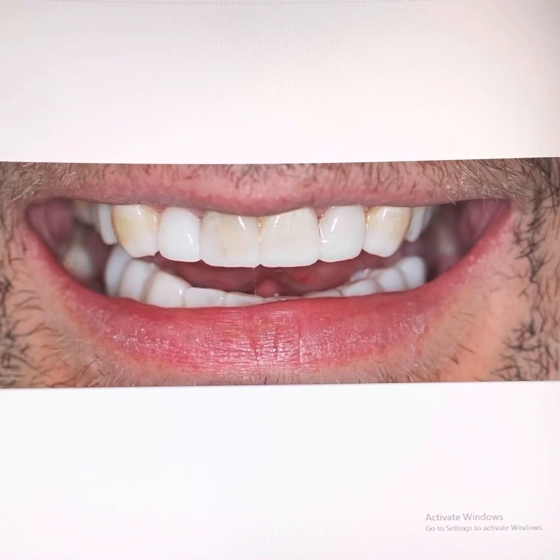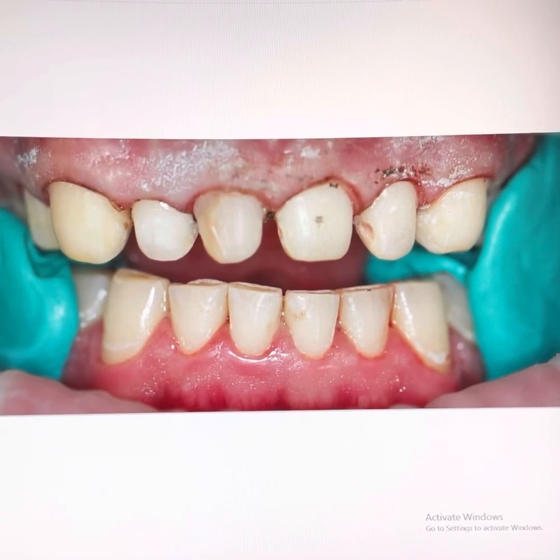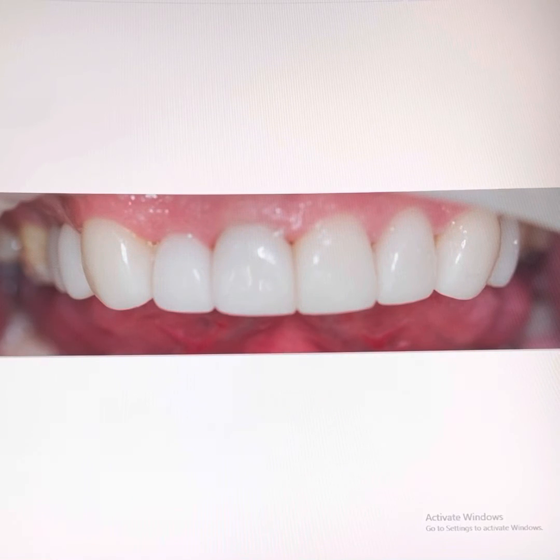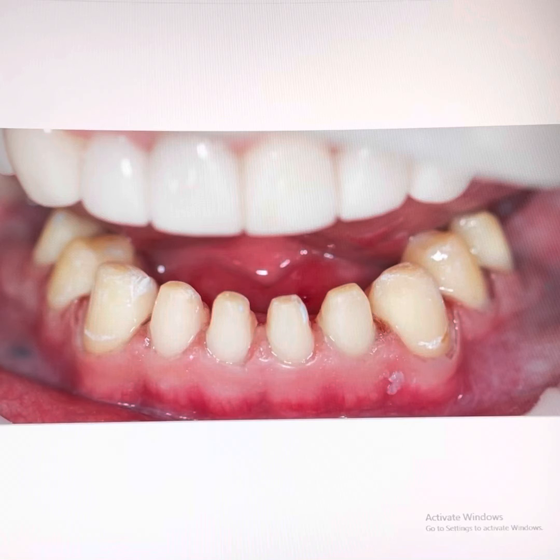The patient is happy with the smile design and smile try-in, so I prepare his upper teeth for crowns, looking like this. We cement the upper crowns on, then in the following week we prepare the lower teeth for crowns, looking like this.